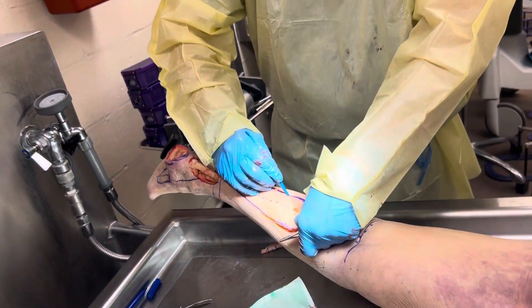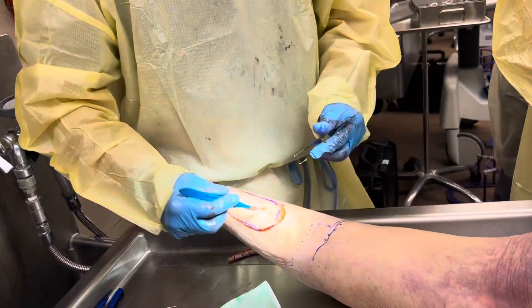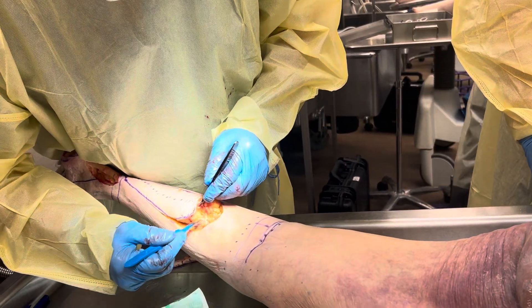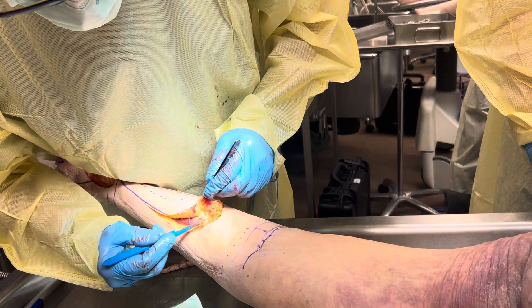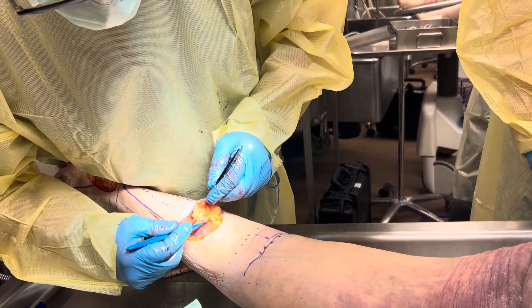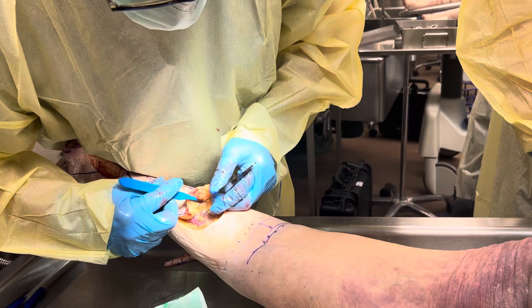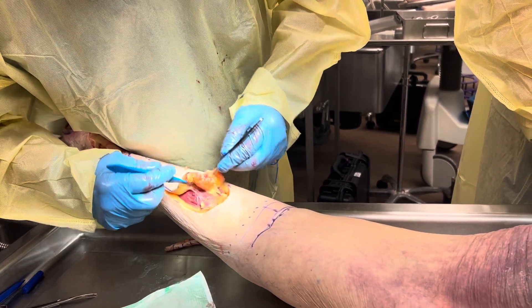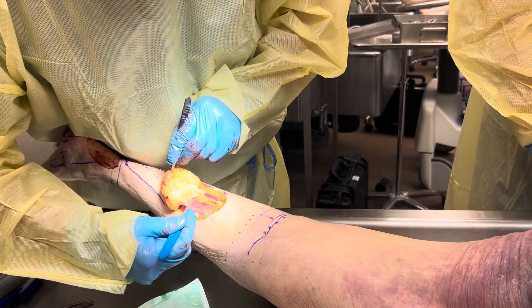Think of fasciocutaneous flaps as a pancake. All the good stuff — the blood supply — is between the two layers of the pancake. You don't want the blueberries falling out. You don't want it to delaminate. So here's our plane. See this areolar plane right here? This is your plane of dissection.